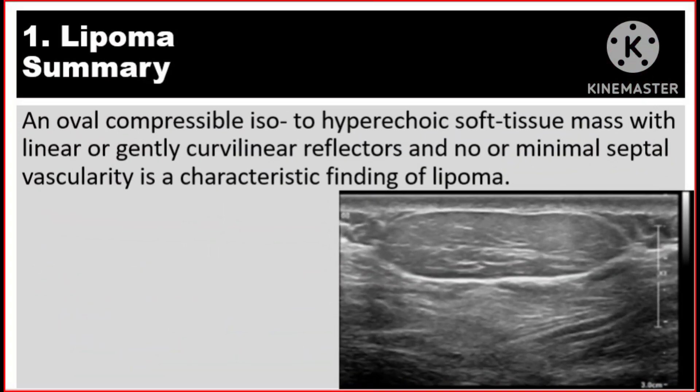Summary. An oval, compressible, iso- to hyper-echoic soft tissue mass with linear or gently curvilinear reflectors and no or minimal septal vascularity is a characteristic finding of lipoma.